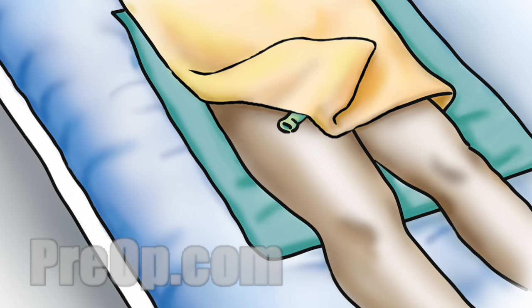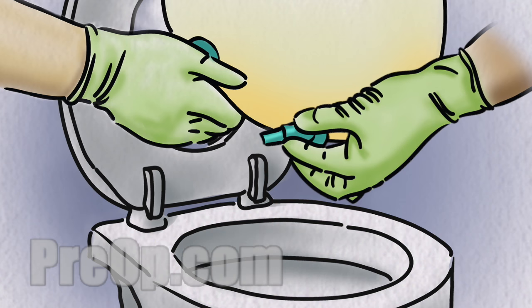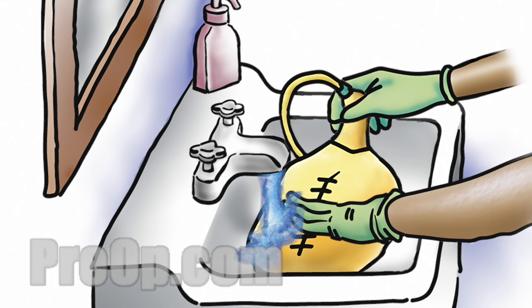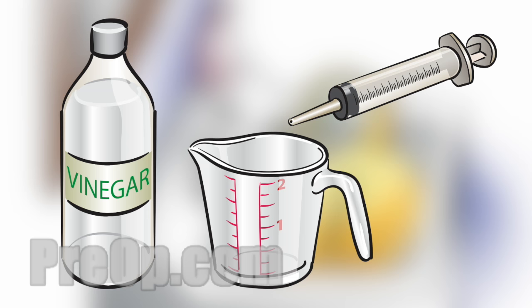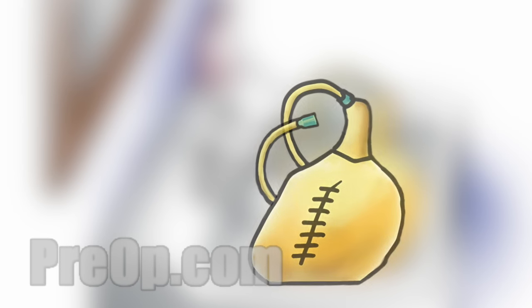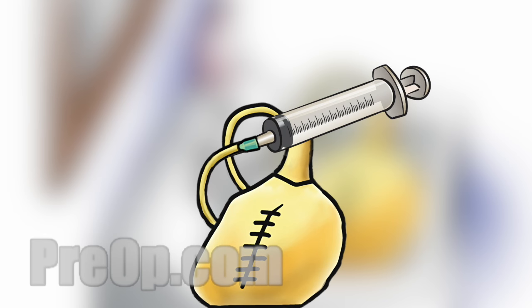If a bag has been disconnected and will be used again sometime later, it must be cleaned. Before cleaning the bag, empty any urine into the toilet using the bottom spout. Do not let the spout touch any part of the toilet. Then wash and rinse the outside of the bag. Next, to clean the inside of the bag, you will need a large syringe, a measuring cup and white vinegar. First, rinse the inside of the bag with plain warm water. You can use the syringe to push water through the tubing into the bag. Let the water drain out and close the bottom spout.